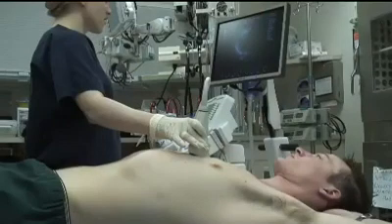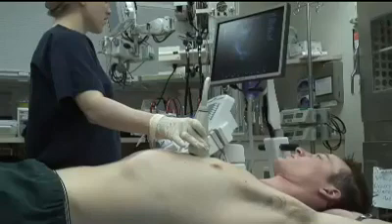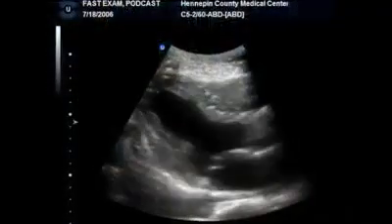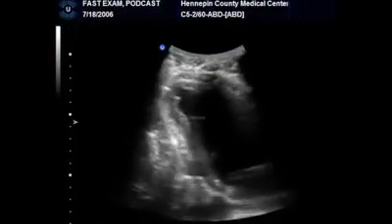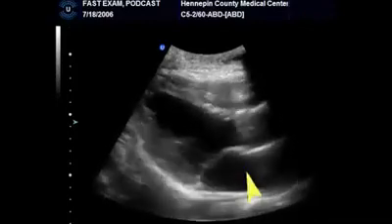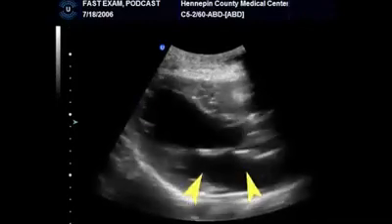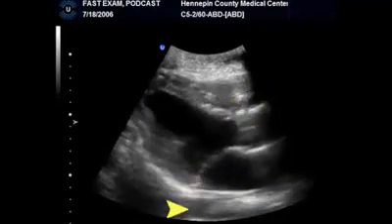The long axis is the easiest parasternal view to obtain. The probe is placed in the left parasternal position between the second and fourth intercostal spaces, with the marker dot pointing towards the apex of the heart. By sliding the probe inferiorly and laterally, you'll be able to visualize around the apex of the heart. The normal structures in this view should be the left atrium, mitral valve, left ventricle, aortic valve, the aortic root, and you may possibly see the descending aorta.